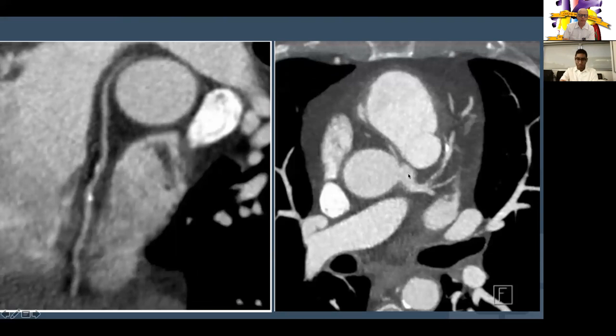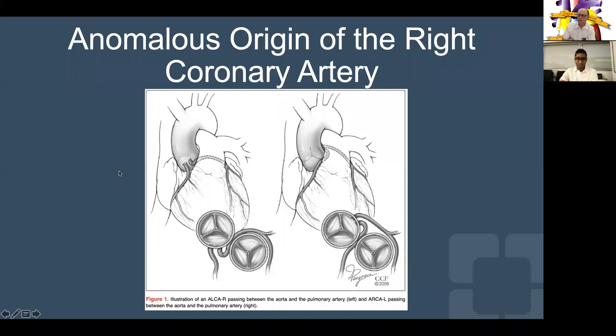A still view shows the right coronary artery with a slit-like opening, acute course, going between the pulmonary artery and the aorta, with some calcification in the RCA as well. This is similar to a paper published out of Cleveland Clinic in 2010-2011, showing the anomalous right coming from the left cusp traversing between the PA and aorta, and also illustrating anomalous left coming from the right cusp.